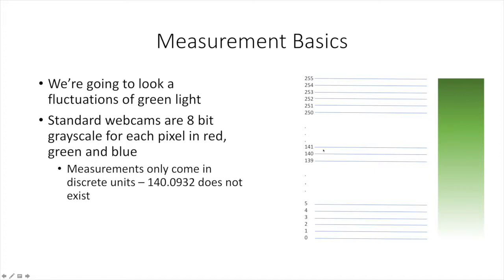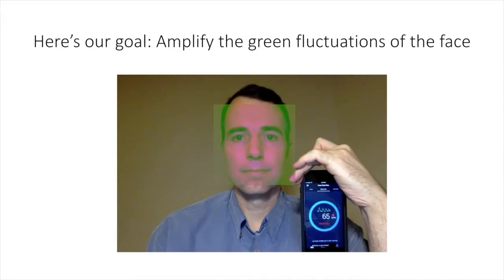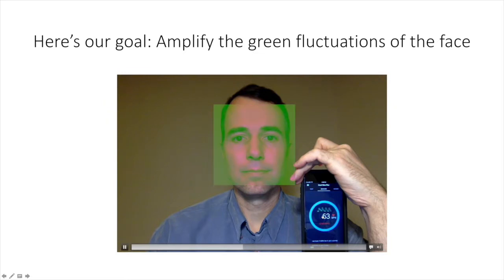To get a more sensitive measure of color changes, we will average the fluctuations over many pixels. I'll show you how to amplify the green fluctuations in a box set by a face detection algorithm. Here is the video that I generated using MATLAB. I have an iPhone app to check that the program gave the same result. This program turns out to be fairly robust to small movements of my head.